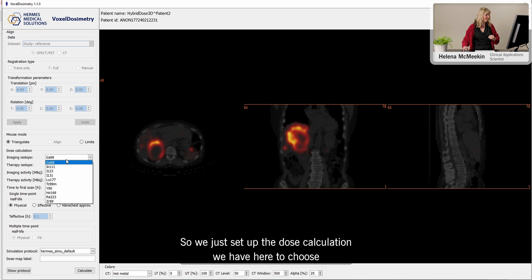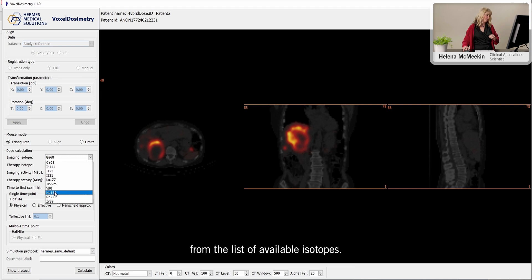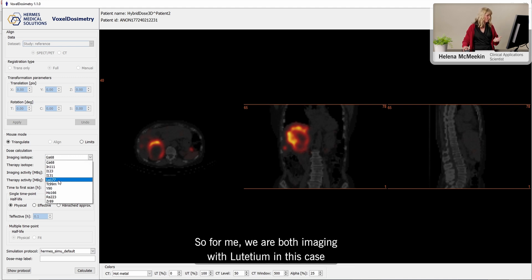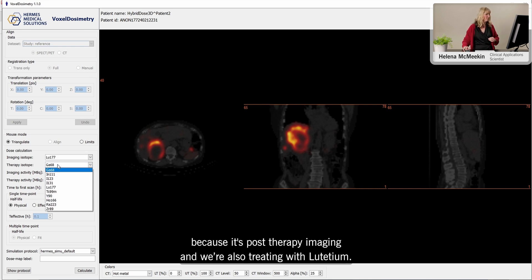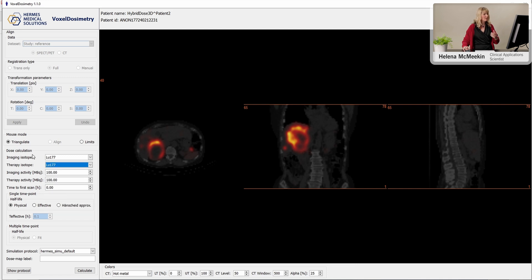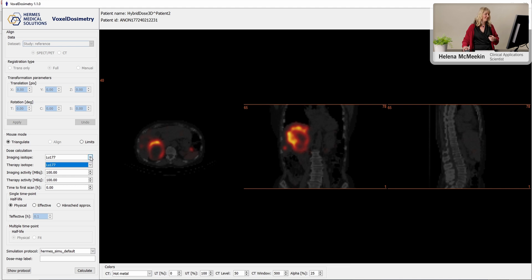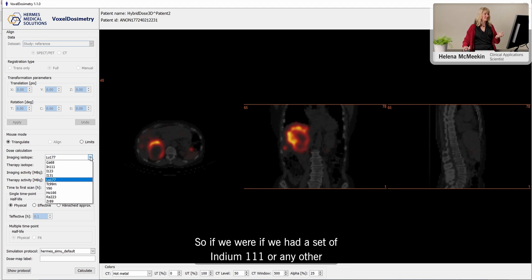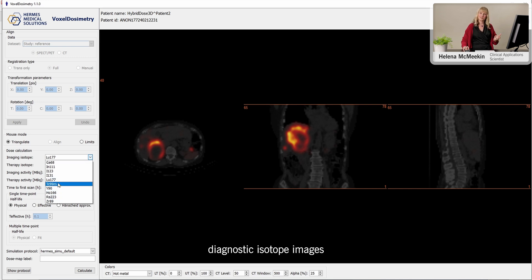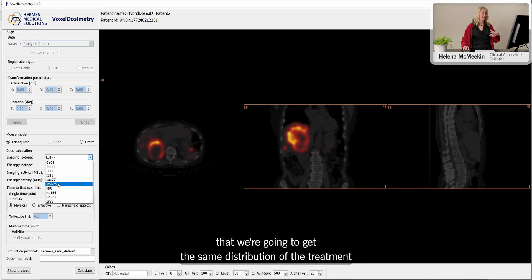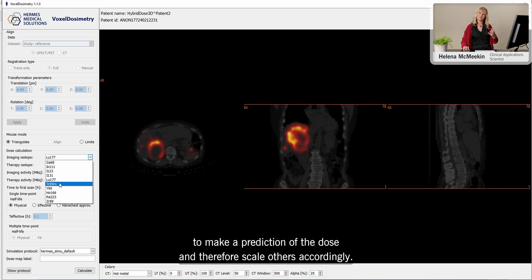So we just set up the dose calculation. We have here a list of available isotopes to choose from. We are both imaging with lutetium and treating with lutetium in this case because it's post-therapy imaging. But you can see here that we have the option to do a theranostic dose prediction. So if we had a set of indium-111 or any other diagnostic isotope images that are going to have the same distribution as the treatment, we can use those to make a prediction of the dose and therefore scale our dose accordingly.